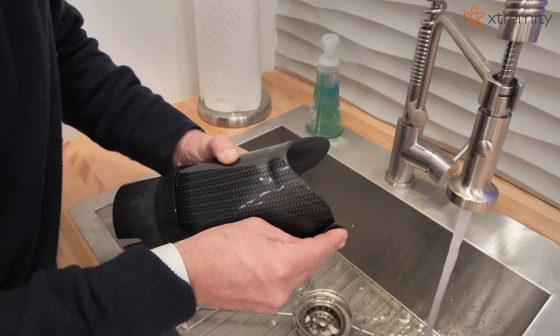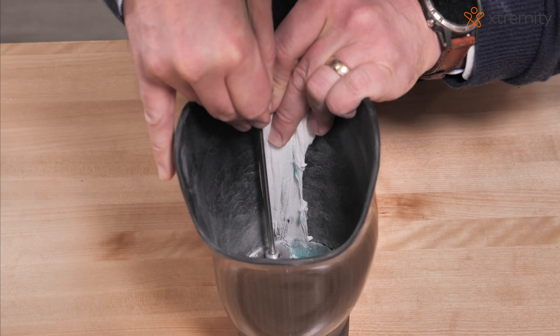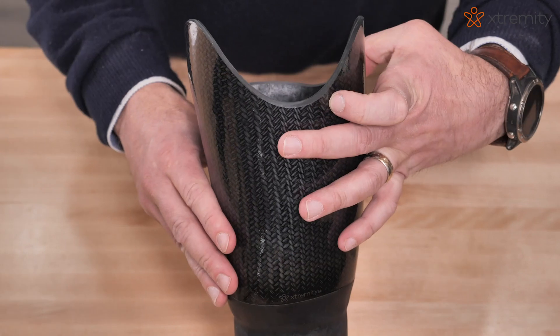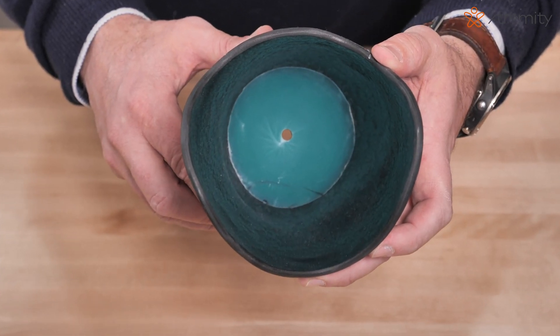Using the rotary cutting stylus, trim the nylon along the edge of the silicone distal end pad and remove the nylon to create a smooth transition from the silicone to the inside of the socket. The distal end pad is permanently adhered to the inside of the socket.